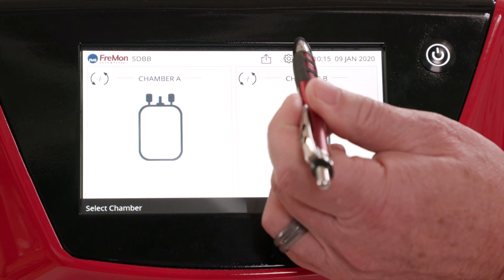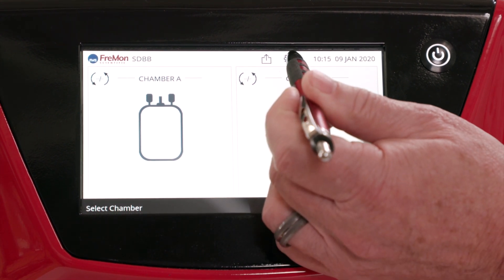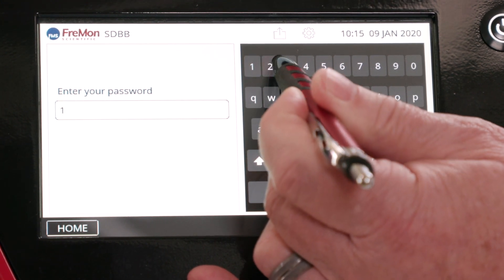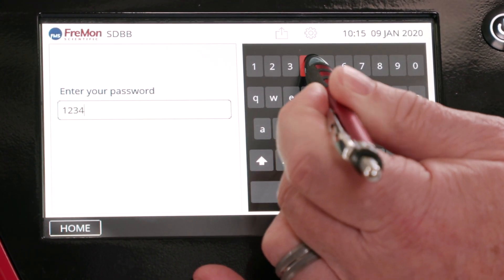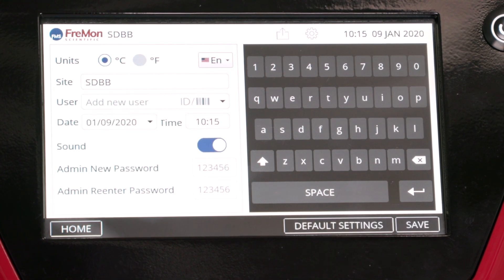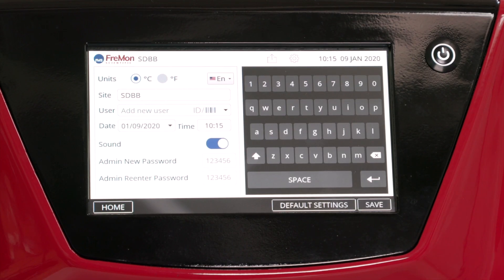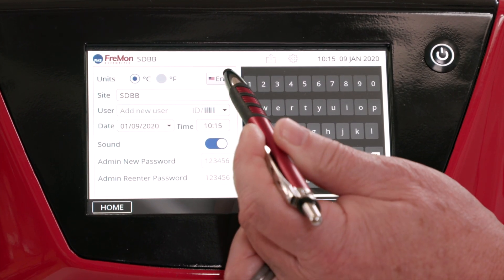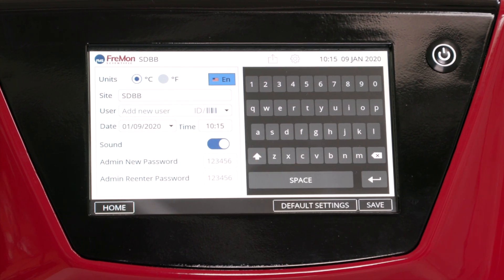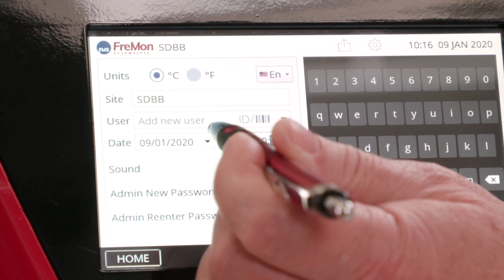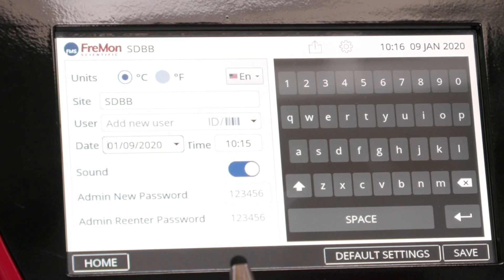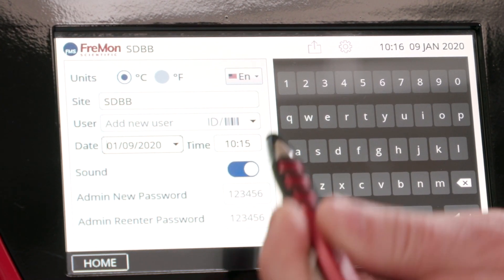You can customize Zipthaw for your needs with the settings menu. We discussed adding new users in a previous chapter. You can also change the language to English, French, or German with the flags. Change the date format to American or international. Enter the date or time, and note the 24-hour format.